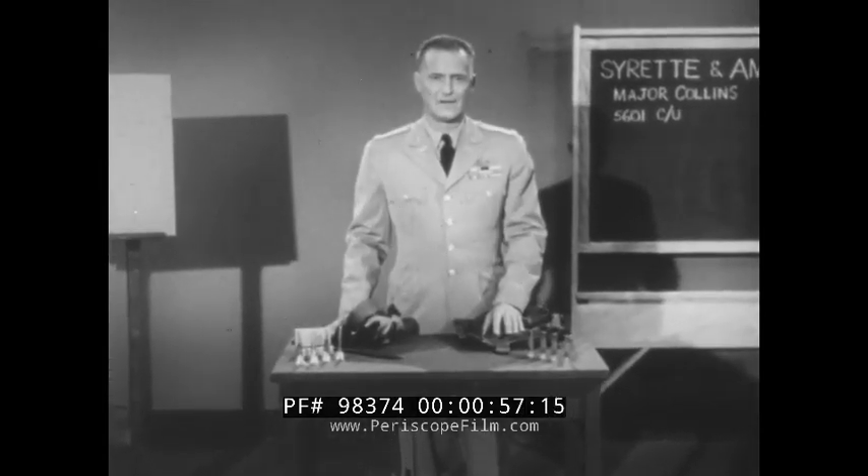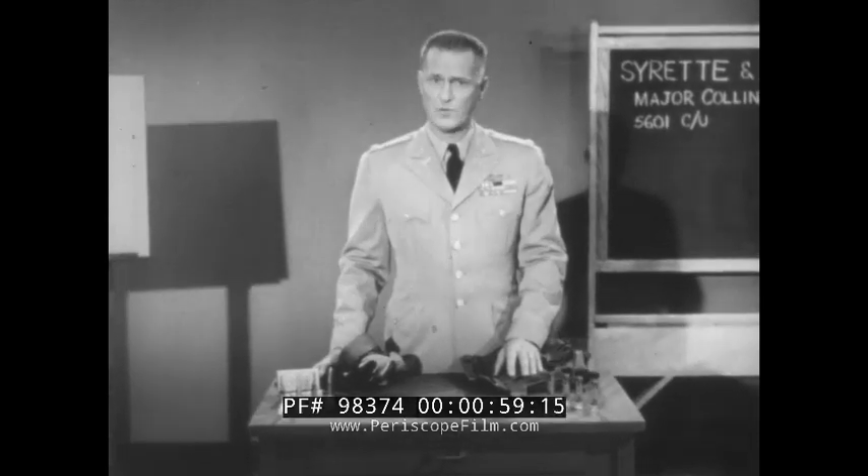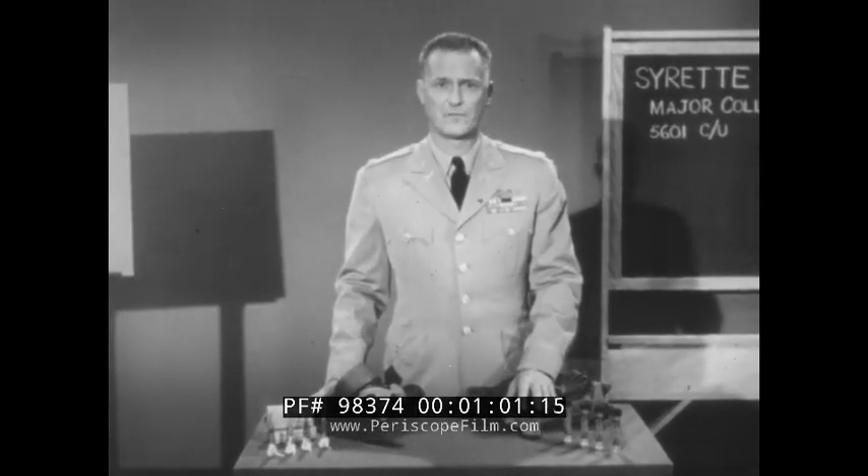You've all heard about the medicine atropine and its value in self-aid against the effects of nerve gas poisoning. Our purpose here is to show you where to find your atropine, discuss the set containing it, and illustrate the steps you must take in using it to get the proper effect of the medicine.